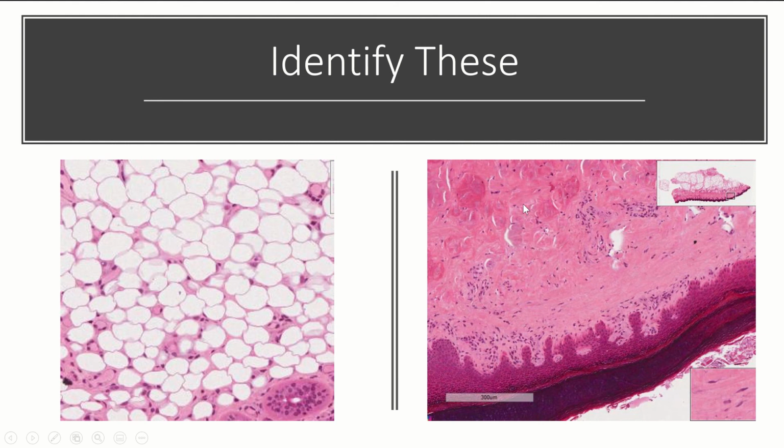So loose, irregular connective tissue. Okay, here, so this one, all of this is connective tissue. Okay, and so each one of these little dots is a little nucleus. And so when you look, especially at an area right here, right? So this fibroblast is all surrounded by connective tissue. You see how much more pink, how much more collagen is in here than in this picture right here.